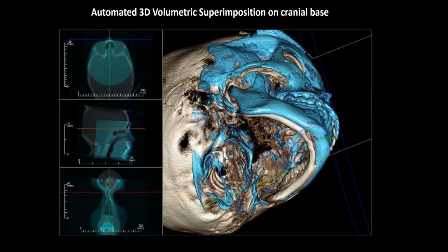So this is critical for instance, if you're trying to monitor cessation of skeletal growth on a patient who needs implants, right? So let's say missing lateral incisors, right? One of the worst things that you can do is put lateral incisor implants too early because the jaws may not be finished growing, when they're not finished growing vertically, right? So it's very important when you're trying to decide the best timing for dental implants to have a better grasp of cessation of jaw growth.